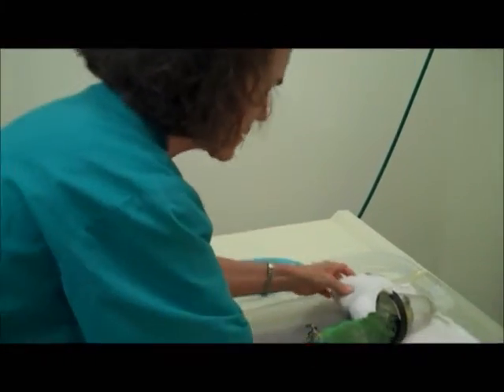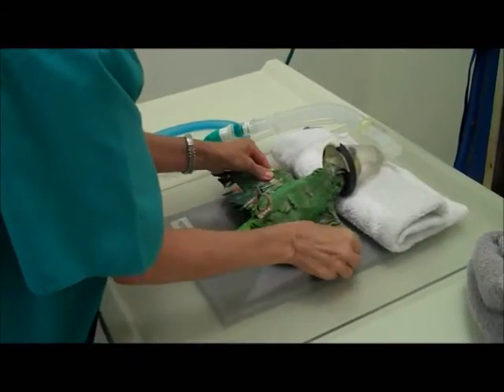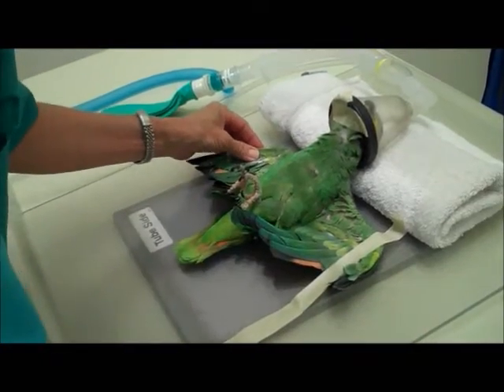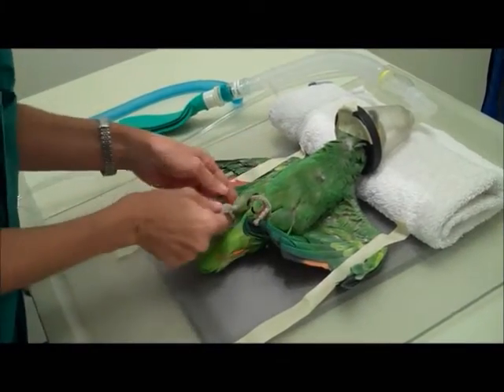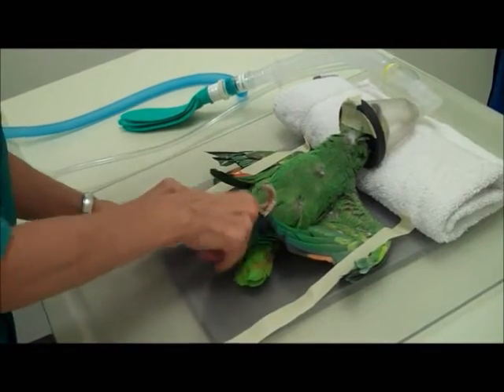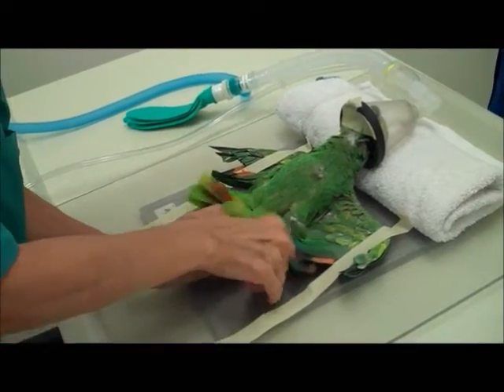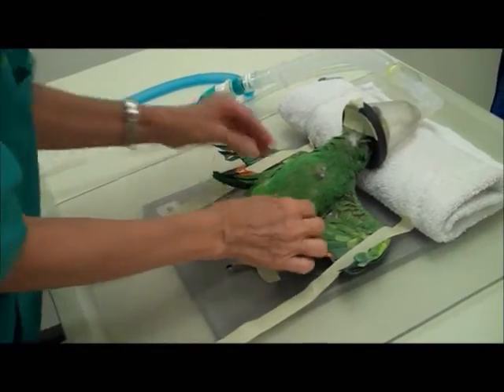It's okay — he does have difficulty breathing. I want him to be very straight on the table so that the read is better on the radiograph. We can see the organs, the skeletal structure, his bones. He's light, but that's good because I want him light and straight. By light I mean light anesthetic. I want him even.